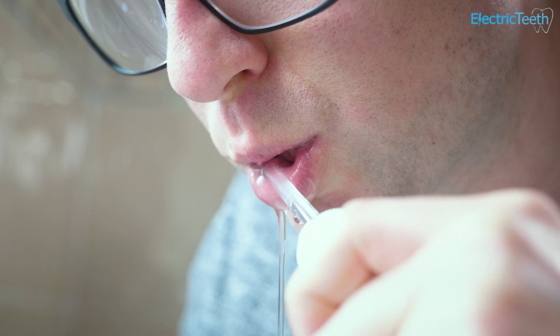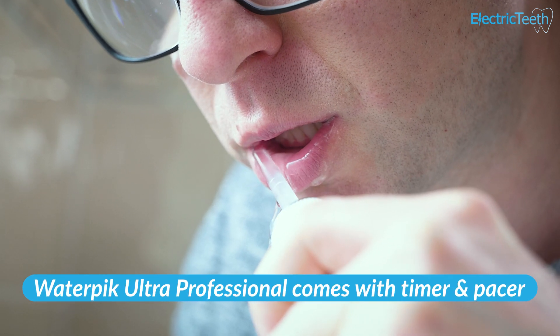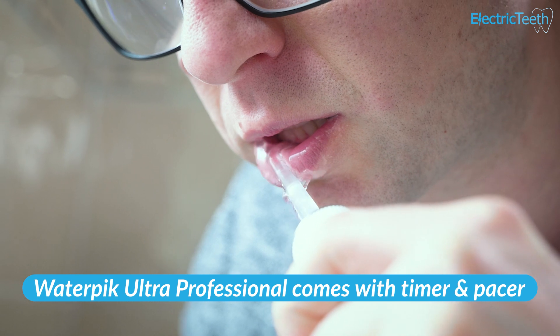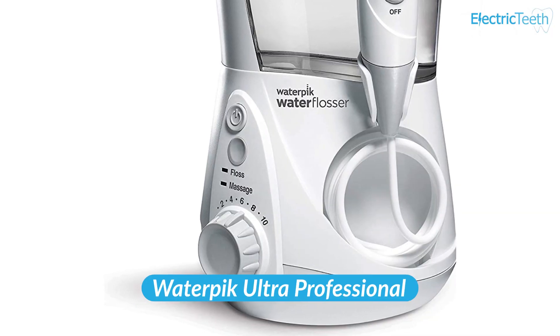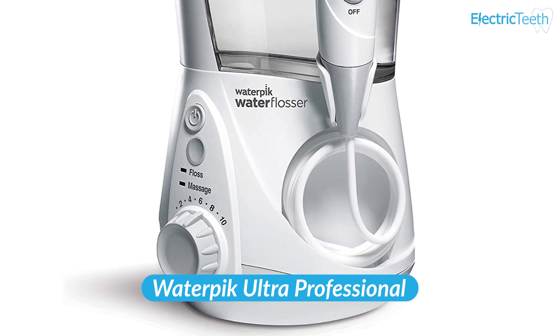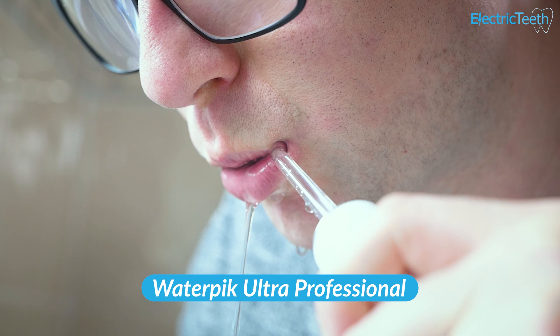The Ultra Professional also has some other slight benefits: a built-in timer and pacer for a nice even clean, a few different colour options, and LEDs on the base unit for the different modes. It's not an absolute deal breaker — the Ultra Plus is a very good water flosser — but because the cost is favourable for the Professional and you get extra features, my recommendation would be to go for that one.